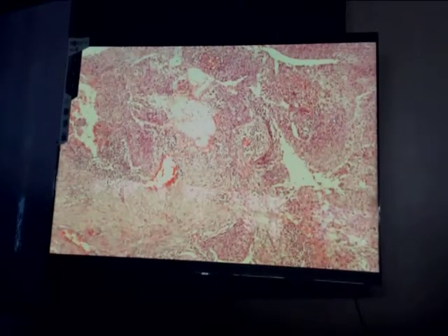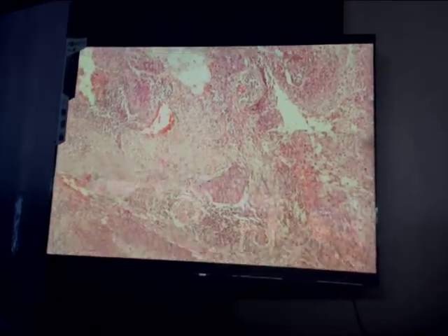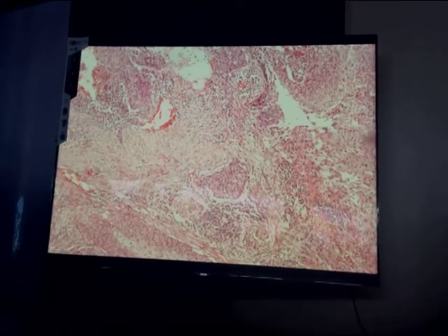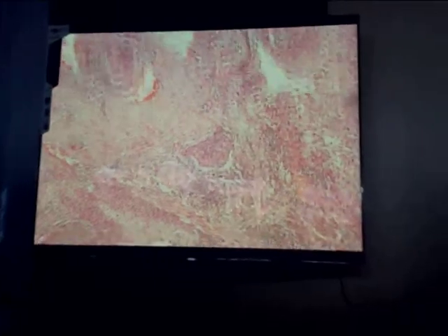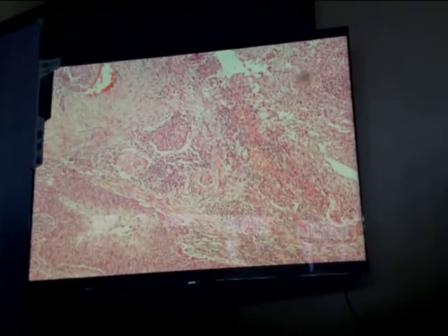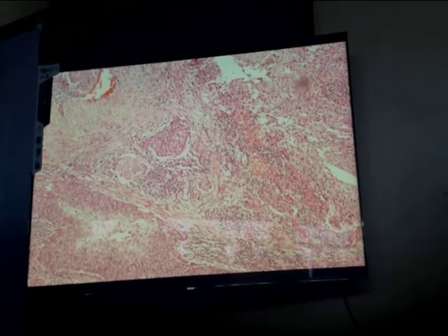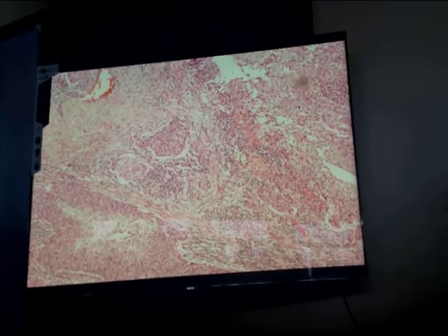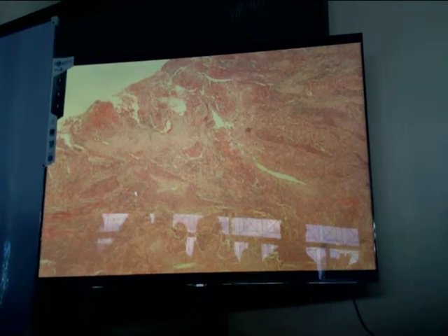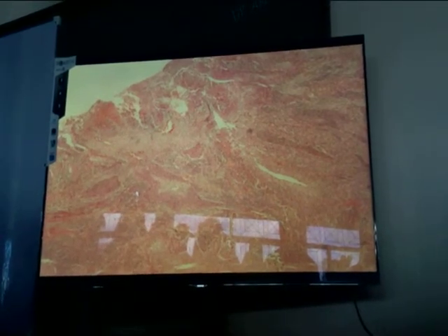So to technically differentiate this malignancy from the in situ, which is still limited by the basement membrane, here we see malignant squamous cells already in the deep tissues of the airway. How do you call that characteristic response of the stroma? Desmoplasia. What is the road for metastasis for this neoplasm, being a carcinoma? The initial road. Direct seeding, lymphatics, blood vessels.